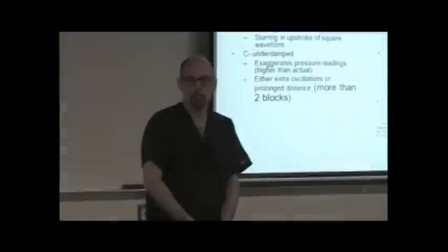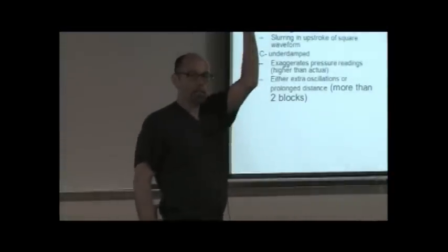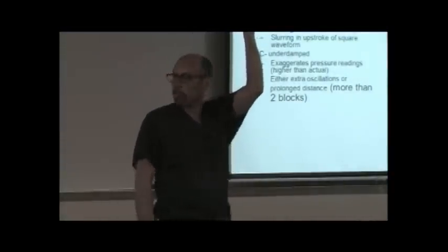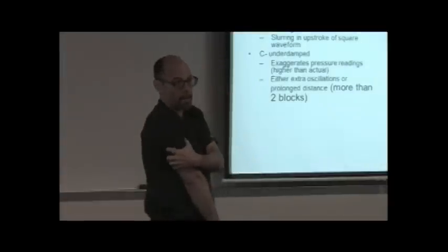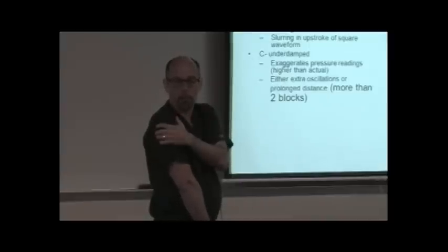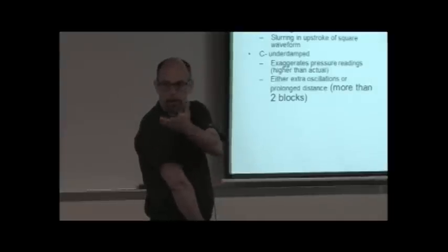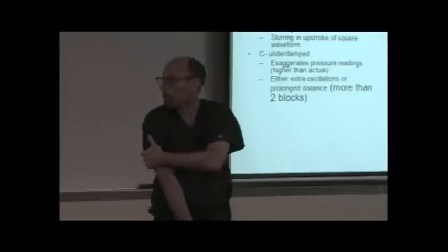All right? So the transducer is leveled at the phlebostatic axis, zeroed to remove the effects of atmospheric pressure, and then maintained at that phlebostatic axis. A square waveform test is usually done once a shift, or anytime you question the values that you're seeing. You're going to do a square waveform test by just pulling or squeezing on whatever rapid flush mechanism there is on the transducer.